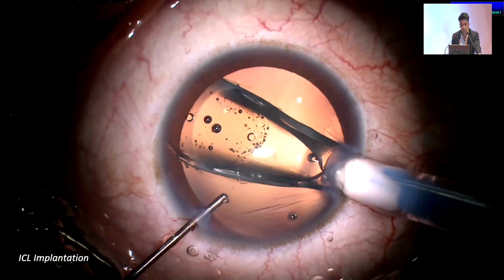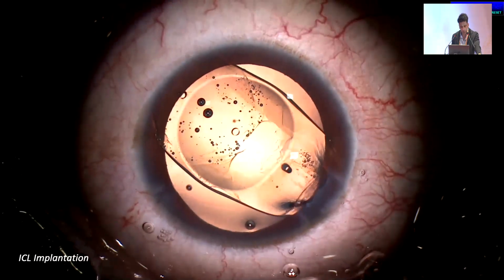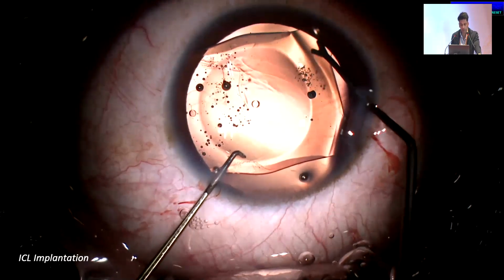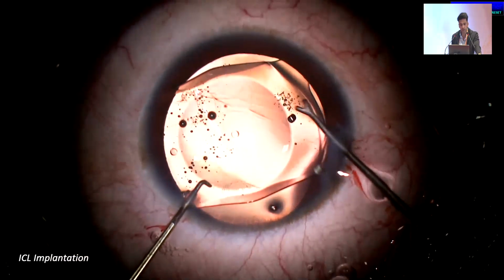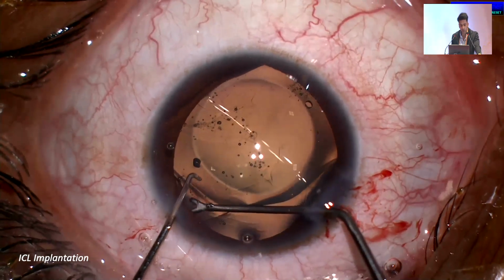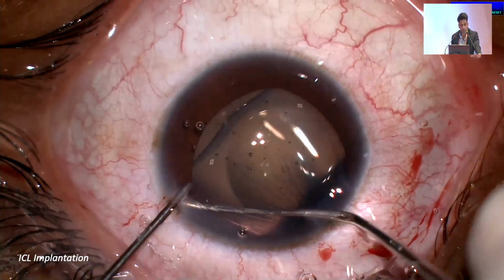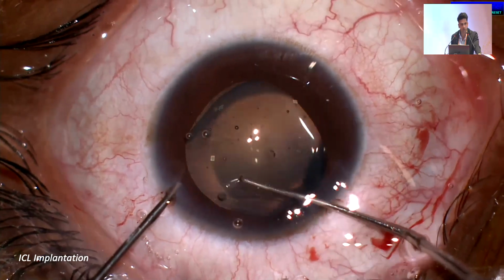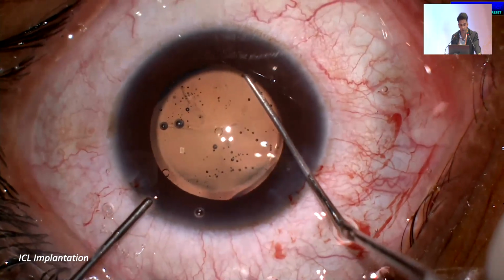So as you're going along, make sure that you're doing it slowly, ensuring that your orientation holes are in the bottom right, as you can see here. And now the footplates are lodged under the iris. The fourth one is always a little more tricky, so what I try to do is flip it on itself, and it rolls back under the iris.